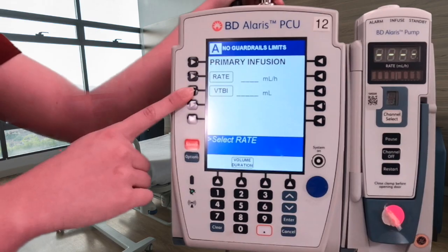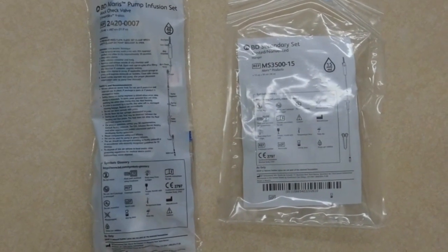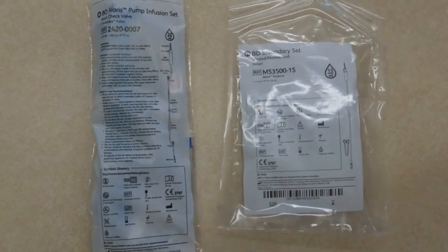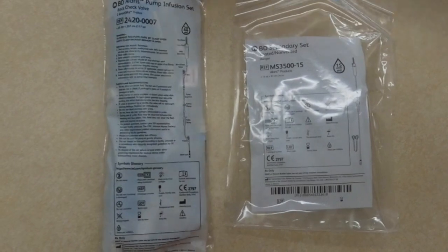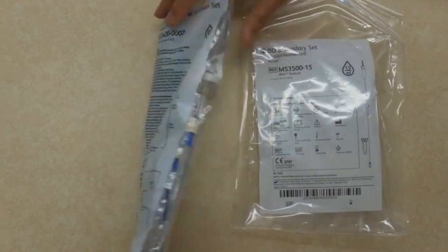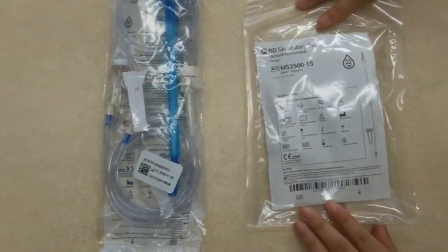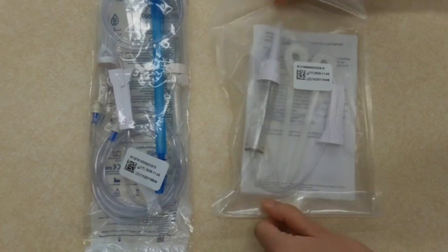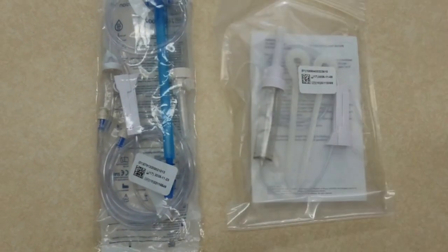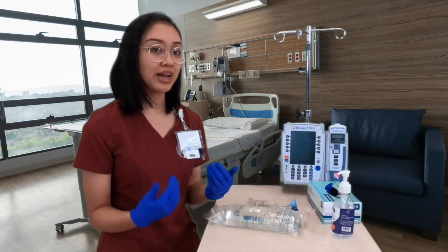To use the Alaris pump, you're going to need two things: first, the Alaris pump infusion set, and second, your secondary set. These are both things you'll be using today.